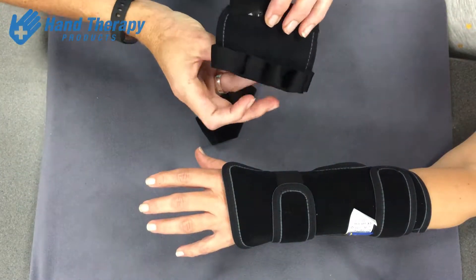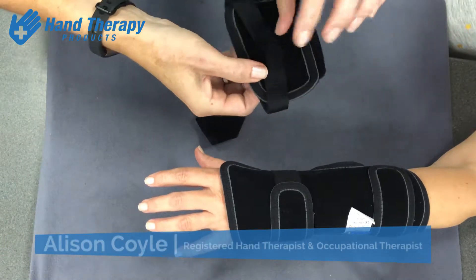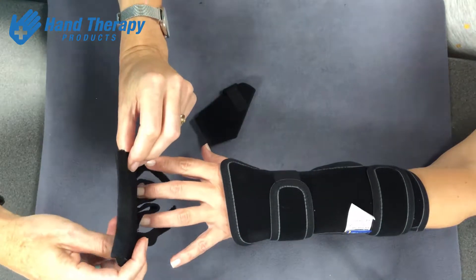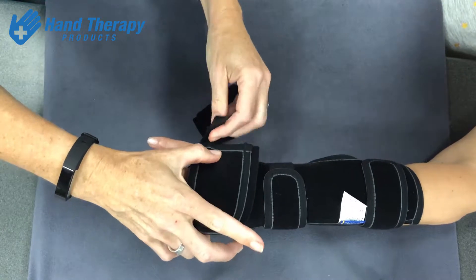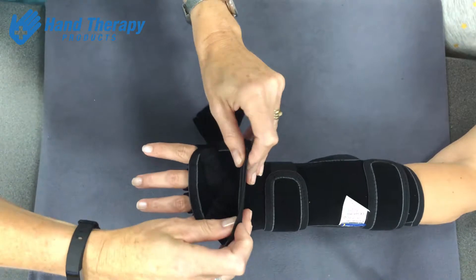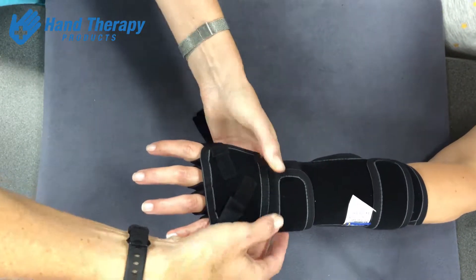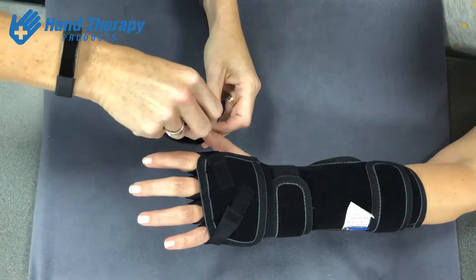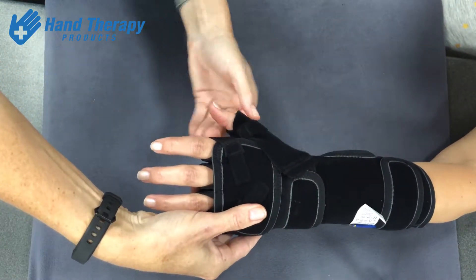You then take the finger piece, which has loops already added, and simply slide the loops over the fingers, taking care not to do them too tightly because of sensory issues. You put on enough tension to help extend those MCP joints. Then there's a thumb piece that you slide on and attach to provide thumb extension.